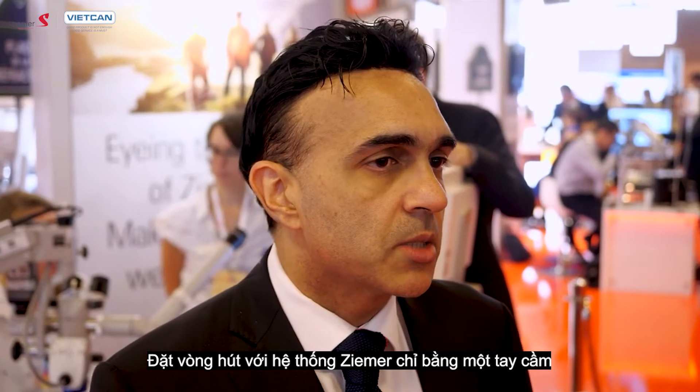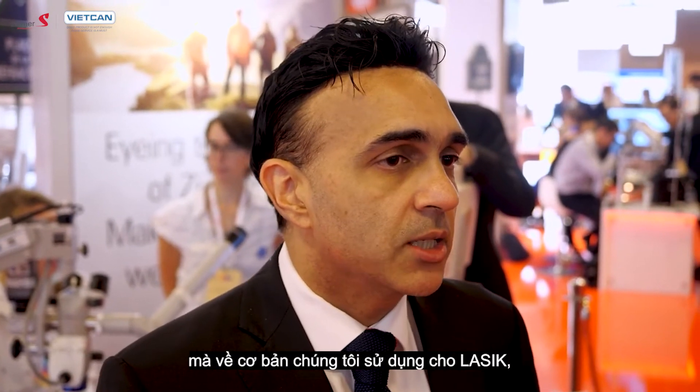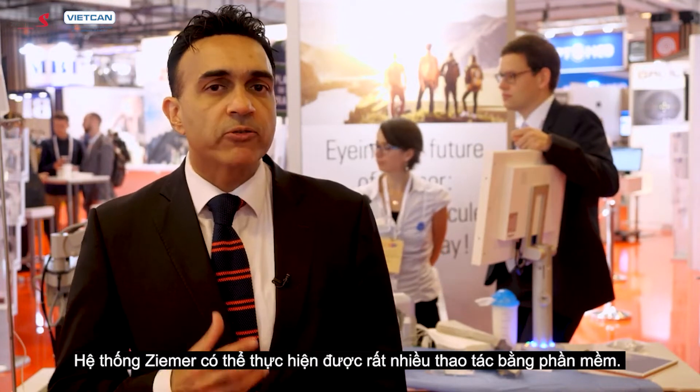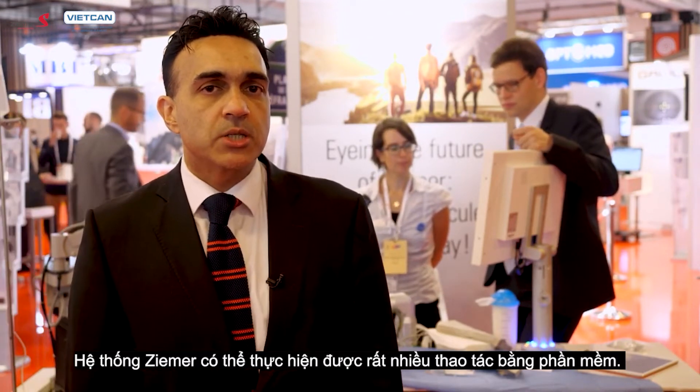The docking with the Ziemer system uses the same handpiece as we use for LASIK — it's a flat, applanating system. There is also a lot of software manipulation that can be done with the Ziemer system.